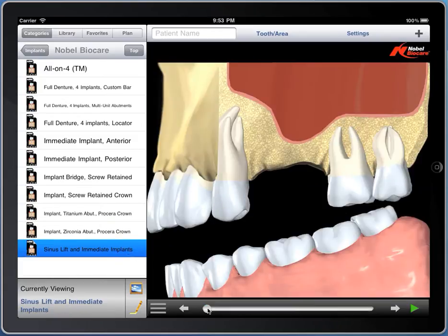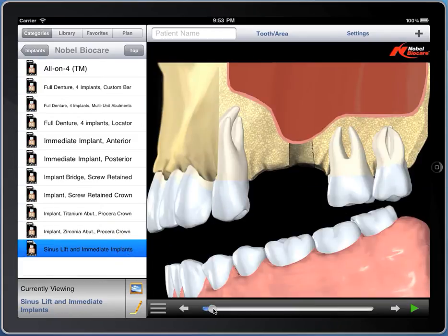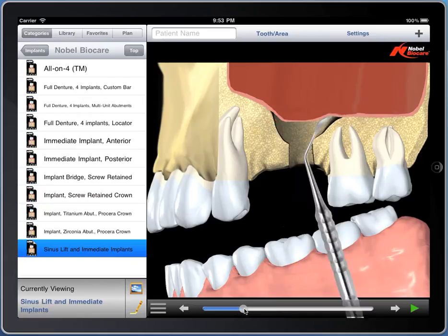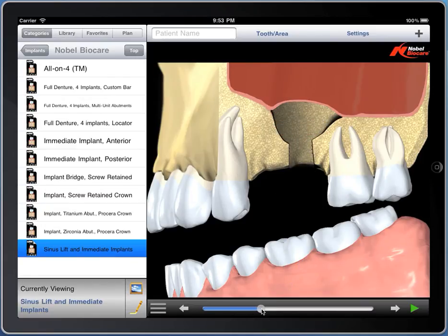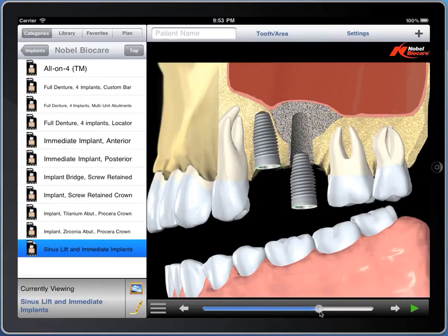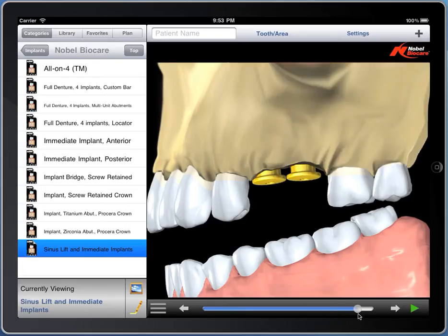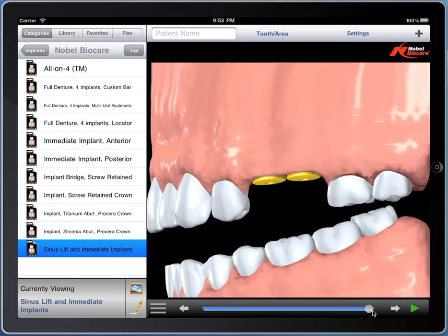And this is a sinus lift where we're showing adequate bone in the anterior, but not quite so in the posterior. We're going to do a sinus lift, place implants, and cover screws while it's healing.